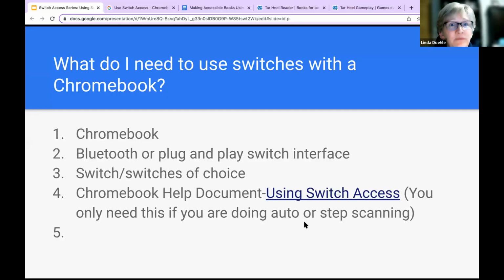Okay, let me ask a quick question. Do you have to reset this up every time you go to use it? No, once you turn it on, it would be accessible. Yeah, as long as you're using the same setup.